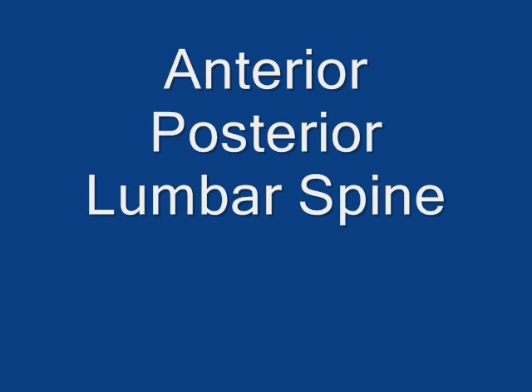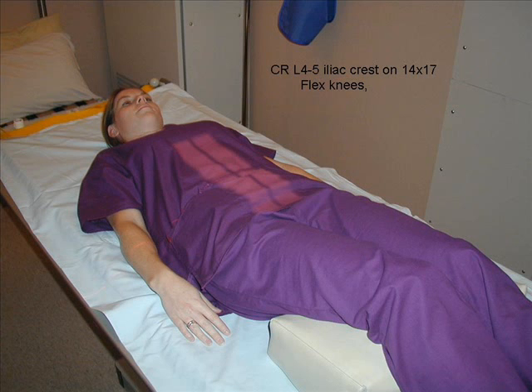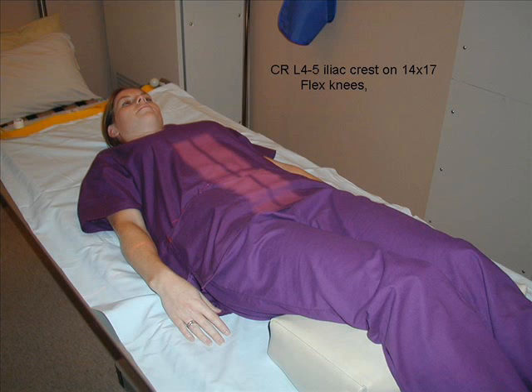Anterior posterior lumbar spine. The patient should be supine with knees flexed to reduce the lordotic curve of the spine.